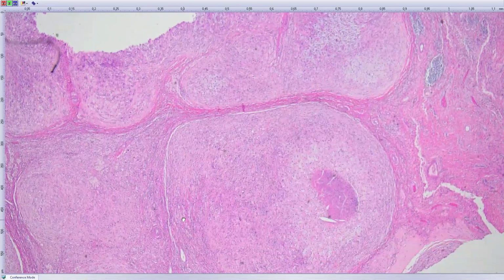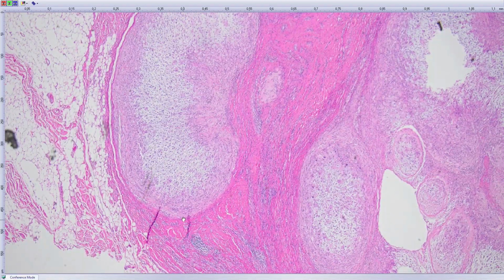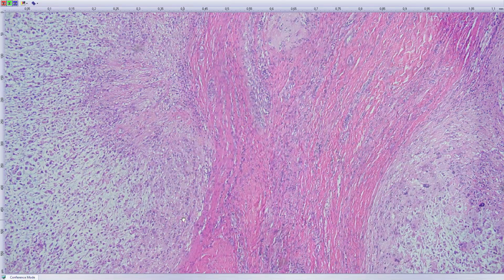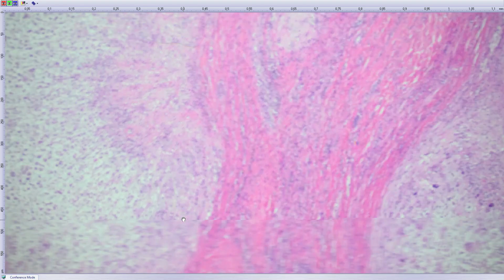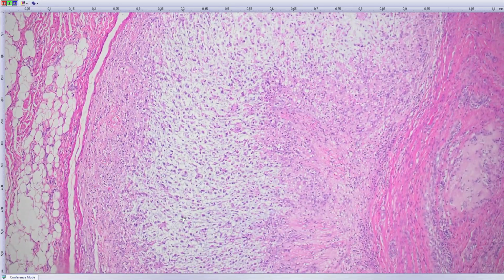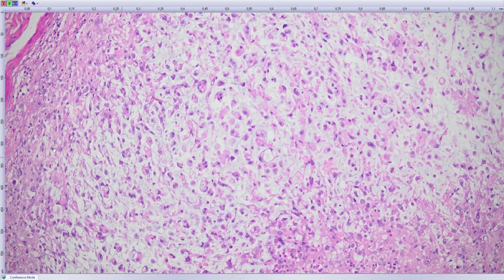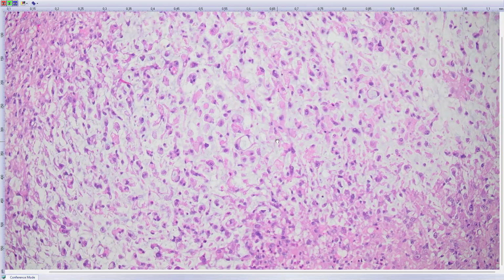These lesions were recently described by Raul Perret. He described 7 lesions of this. He found that all these lesions of his were YAP1-MAML2 translocated. And microscopically, you see the lesion is typical MIFS, typical myxoinflammatory fibroblastic sarcoma, with these typical soccer ball-like cells with emperipolesis.